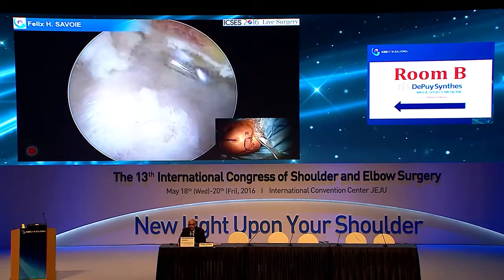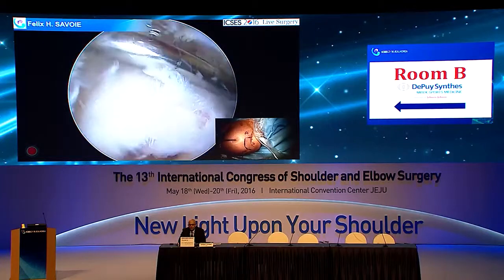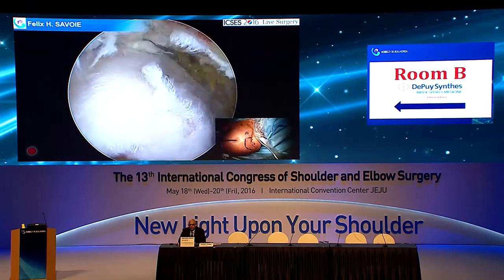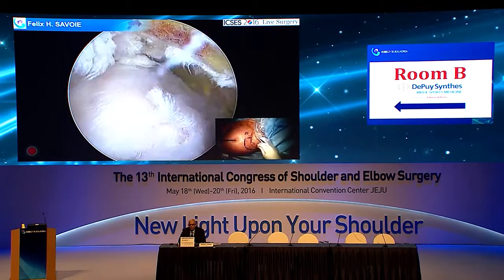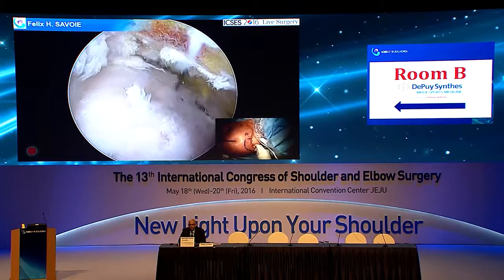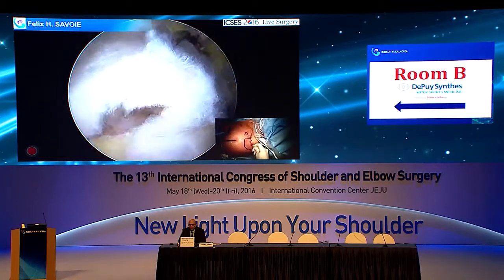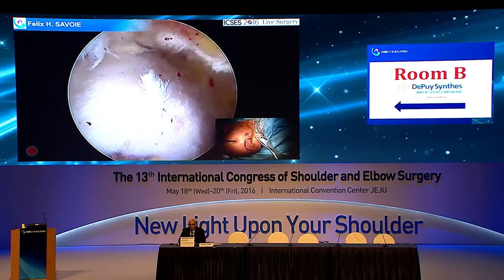But you can see how we just clean up over here. Here's the spine. And so we feel pretty good about passing our sutures. The one thing we might want to do is use the spinal needle and see if maybe a Neviaser portal might be a good way to pass some sutures. So here's our spinal needle coming in here. So that would give us a nice straight shot on passing sutures should we want to. So we'll put a little puncture there for in the future.